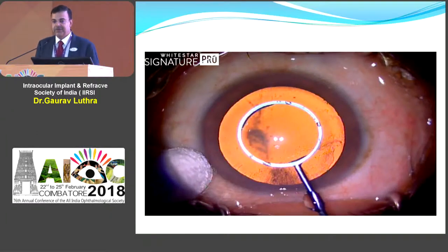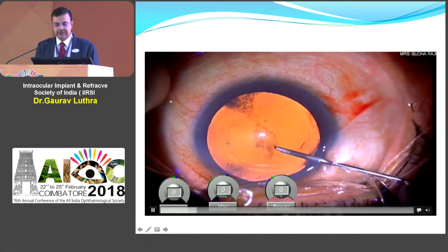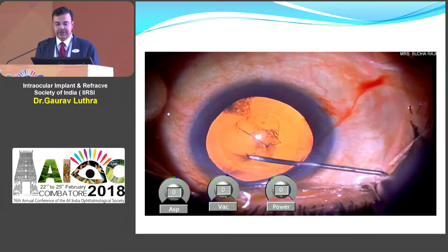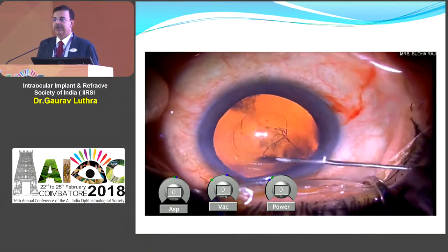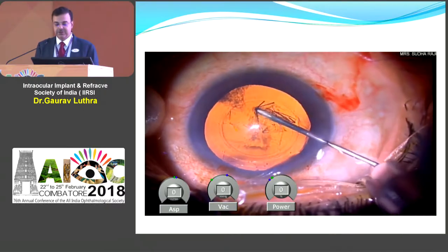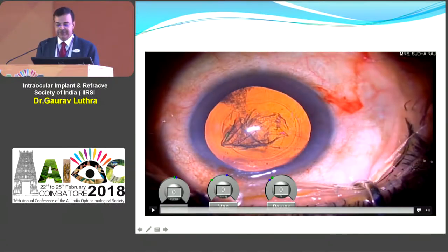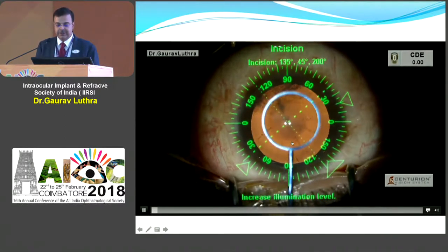Obviously everybody does the rhexis in different ways, but this makes life very easy. You just leave that small indent on the cornea — you can see the mark it leaves. This mark is there only for a couple of minutes and it's gone by the time you finish surgery, but it gives you a very nice way to get your rhexis size and shape perfect. It costs almost nothing and can be used for thousands of cases.